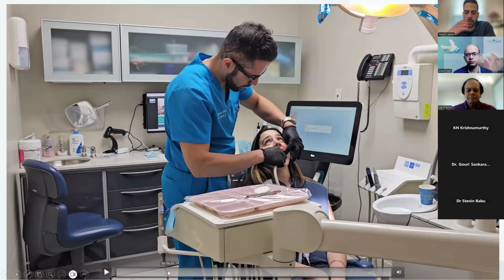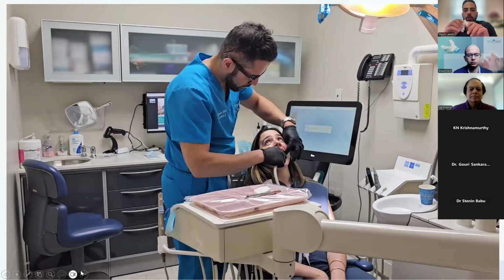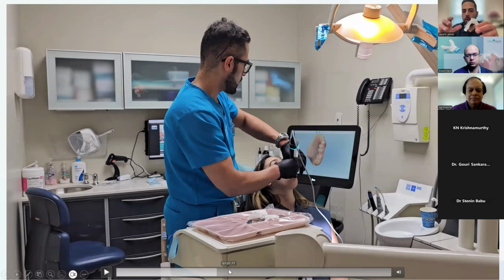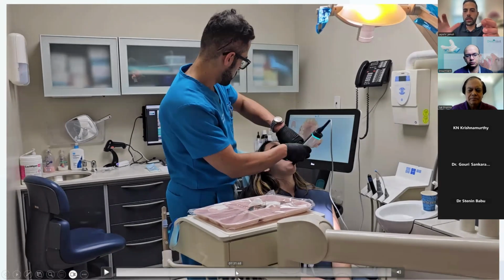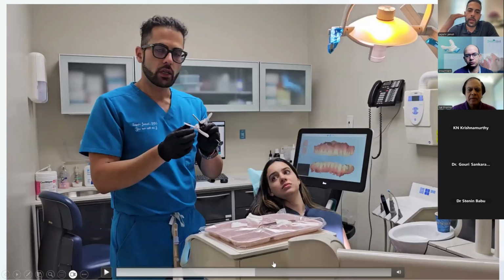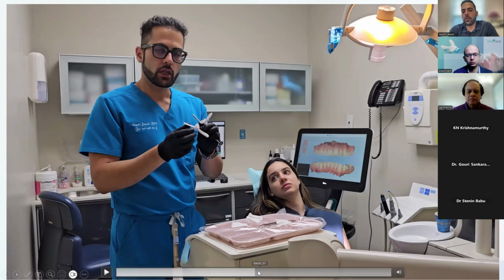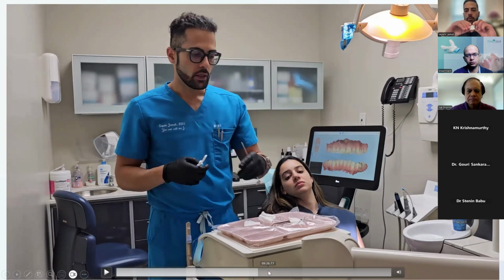One is that, again, because these appliances are 3D printed nylon, we don't have that much ability to modify. They're not like the acrylic appliances that were easier to repair and add to. We have to make sure that the scan is very accurate. So we want as little saliva as possible. And we want to scan the full arches with at least 3 millimeters below the gingival margins of all the teeth, so the lab can trim the appliance properly.